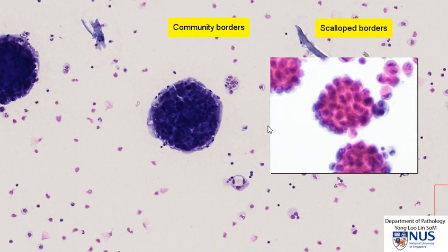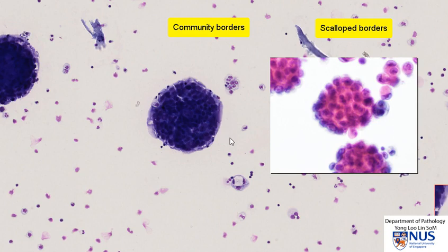Scalloped borders are more associated with mesothelial cells. However, this is not a hard and fast rule — sometimes they can be seen in epithelial cells as well. When we see smooth community borders, we are usually a little bit worried because they are often seen in metastatic carcinoma.